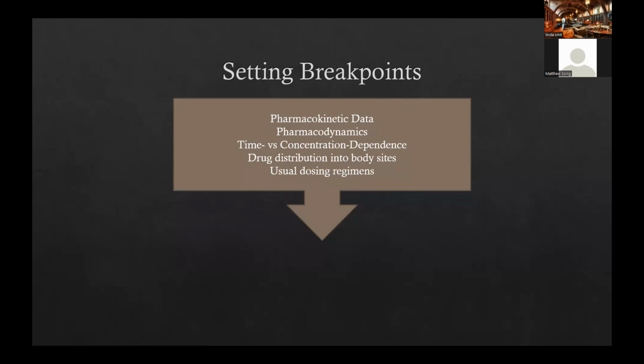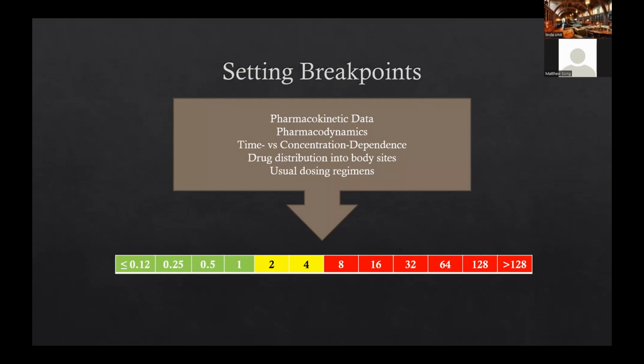That's a topic for one of our pharmacy people if they want to tackle that at some point. But notice also, it depends upon usual dosing regimens. How much is it common for people to dose this drug? What's the typical dose? Because that's going to be really important. But you take all of that, you put it all together, and you come up with a set of breakpoints.